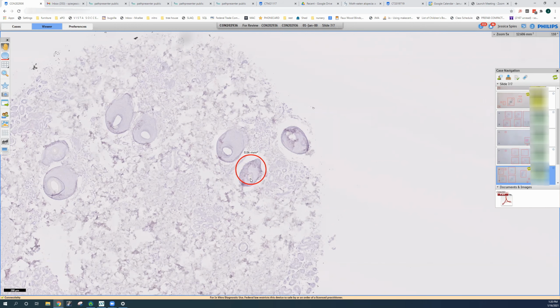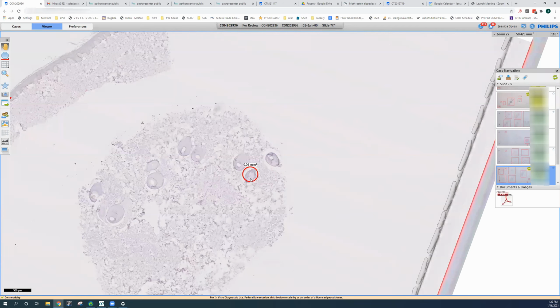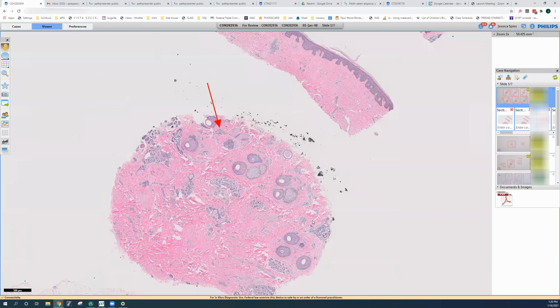So the differential diagnosis for syphilitic alopecia is, let's go back to our H&E stain. So we've got a catagen telogen shift here. This is probably 2 out of maybe 10, so 20%. You can see catagen telogen shift in alopecia areata, which also presents in a patchy fashion clinically, and particularly in subacute alopecia areata, you actually get a very large catagen telogen shift.